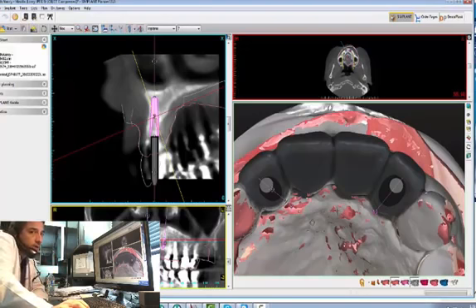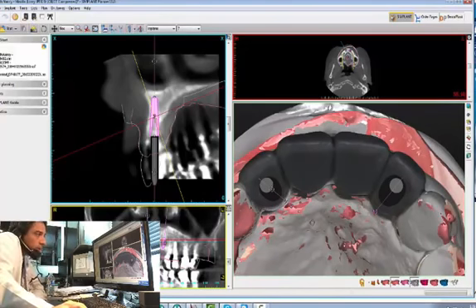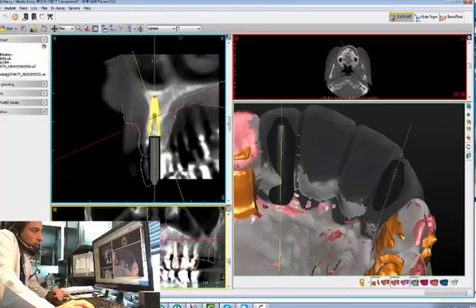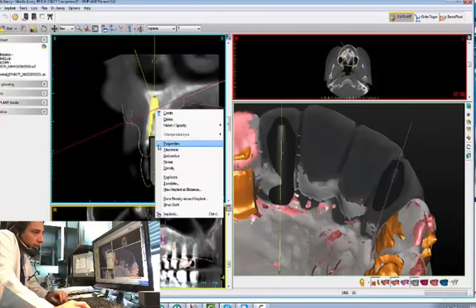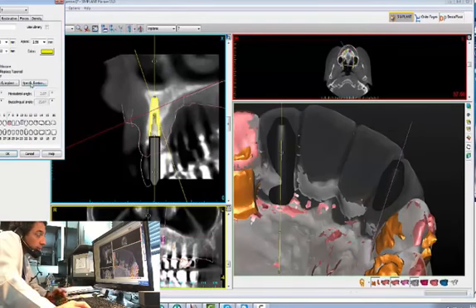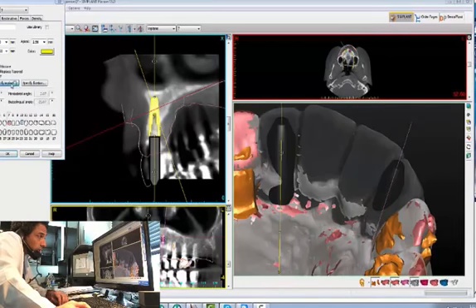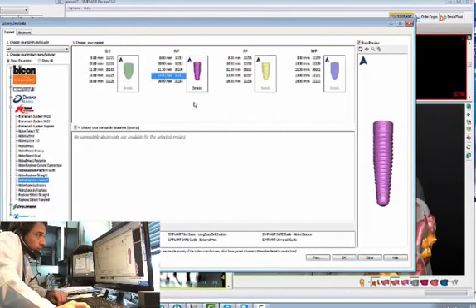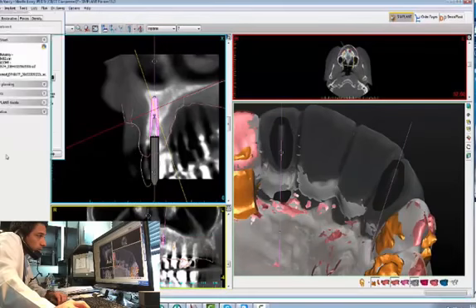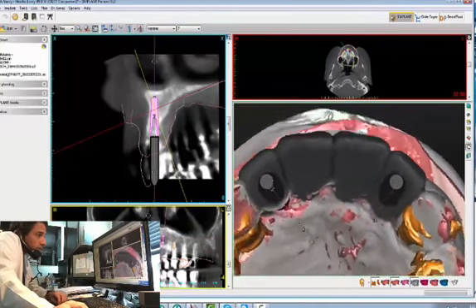Both of these implants are 3.5mm in diameter, conical connection, with a 13-millimeter length. When we put a 4.3 in there, there's not going to be any ridge left and you start getting failures. I would love to put a 4.3 — it's just not possible without additional grafting. I'm not sure she's really into that, so I'm going to put it back to the 3.5, from a restorative position.